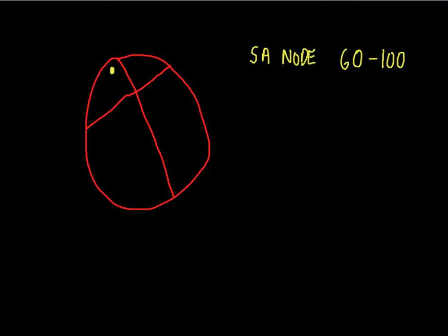So what I'm going to do is turn these off for a second, and now I want to talk to you about what actually happens when I have a cardiac depolarization. This is just your very brief, quick intro into what happens with a waveform. How do we actually see this electrical energy?